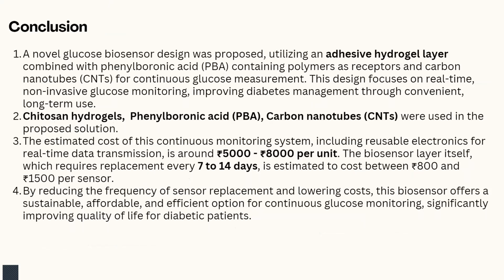Concluding the entire discussion, the glucose biosensor design proposes an adhesive hydrogel layer combined with phenylboronic acid and carbon nanotubes for continuous glucose measurement. This device focuses on real-time, non-invasive glucose monitoring, improving diabetes management through convenient long-term use. These were the materials used in our proposed solution, the polymers used, and the estimated cost, as we can see, is quite low compared to the market analysis that we've done.